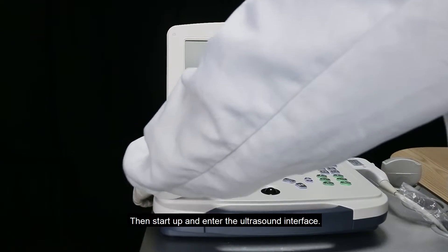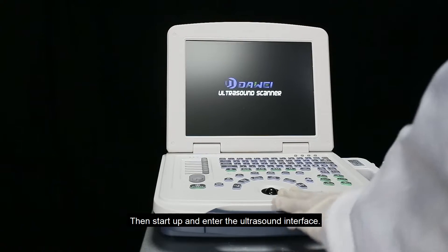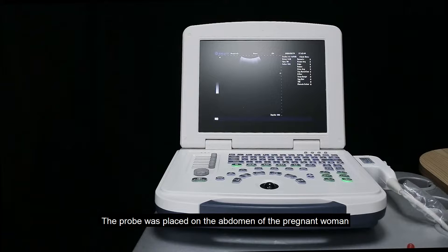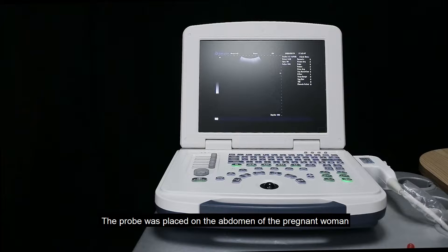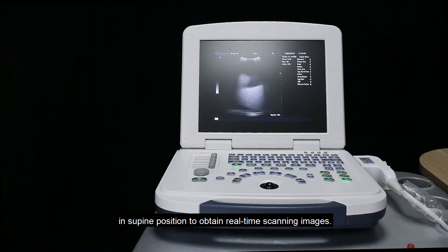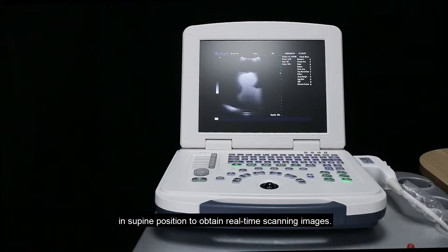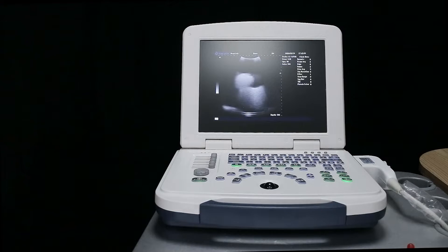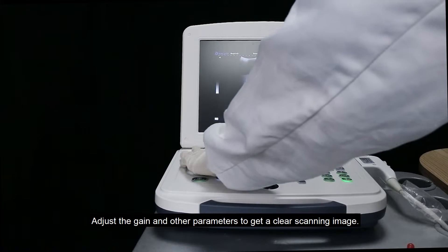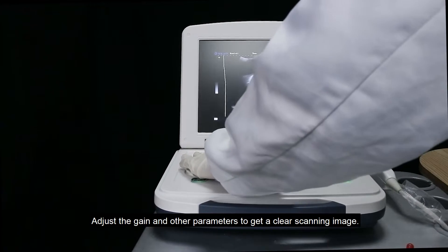Start up and enter the ultrasound interface. The probe is placed on the abdomen of the pregnant woman in the supine position to obtain real-time scanning images. Adjust the gain and other parameters to get a clear scanning image.